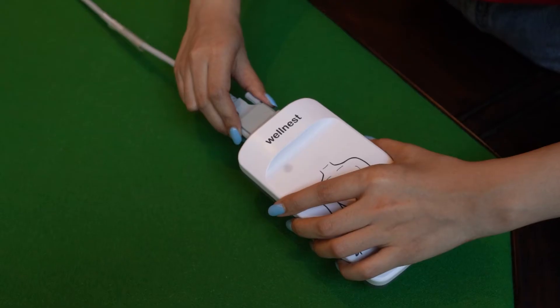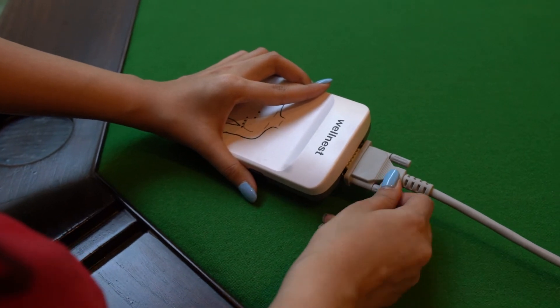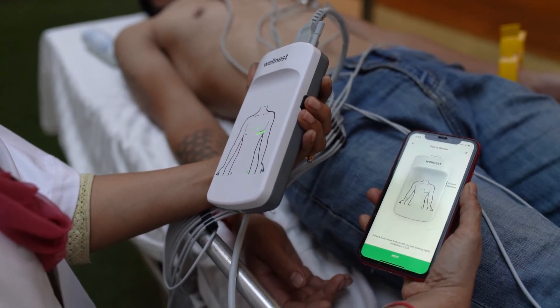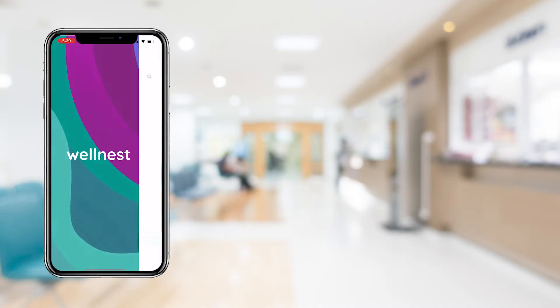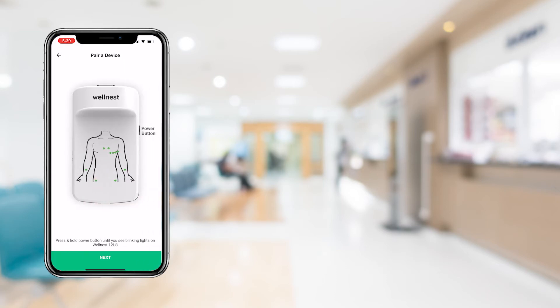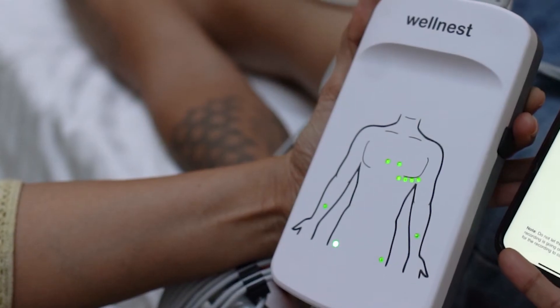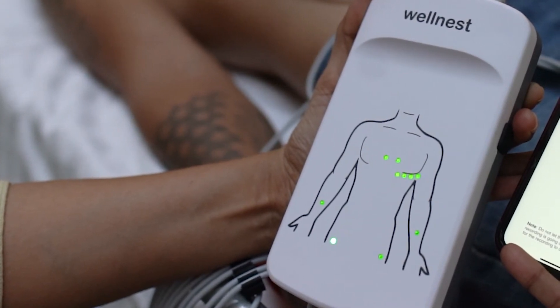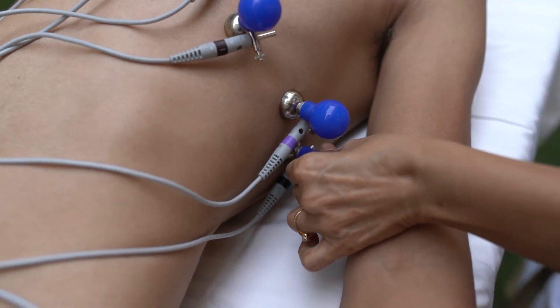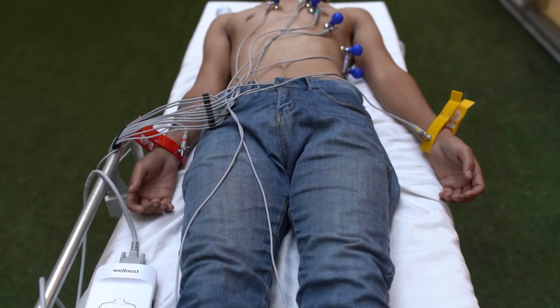If you have not done so already, attach the other end of the ECG cable to the 12L ECG device and tighten the screws. Now, long press the power button on the device to turn it on. Open the Wellnest 12L app on your smartphone and click on New Recording. Complete the pairing process to begin recording the ECG. Before proceeding, ensure that all the LEDs on the device are green, which indicates that the electrode surfaces are in touch with the body. If a certain LED is off, check its contact with the body. For further information on the LEDs, refer to the LED Feedback Mechanism segment.